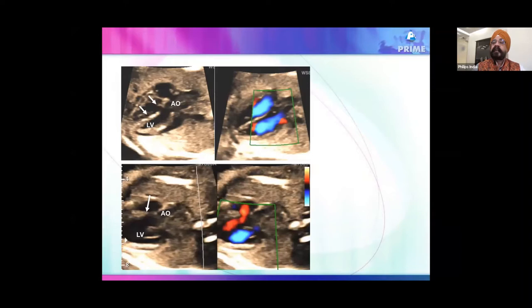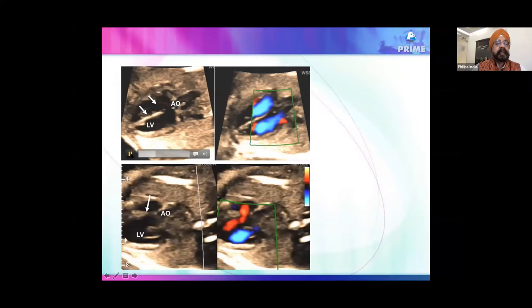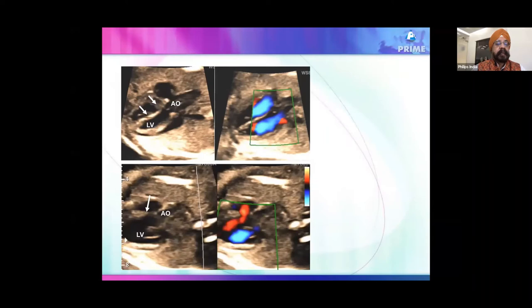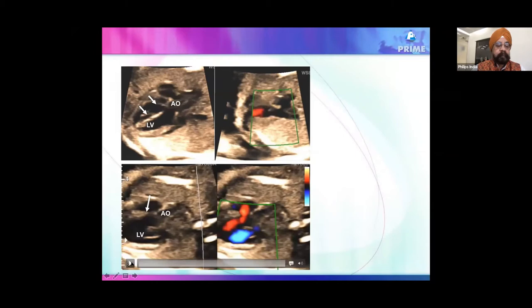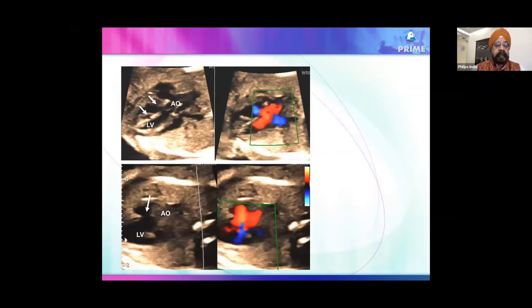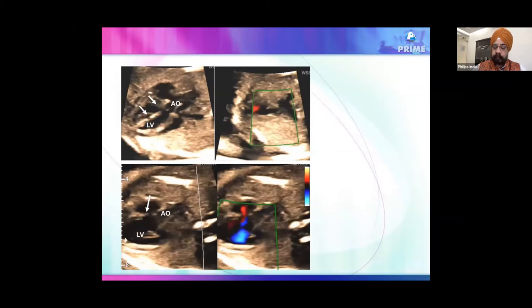Here is a case where on 2D it looked like there were two VSDs in the muscular portion, depicted by arrows, but when color was applied, there was no flow across them — they were pure dropouts. In contrast, in another patient, there was a large VSD with clearly visible flow across the area.